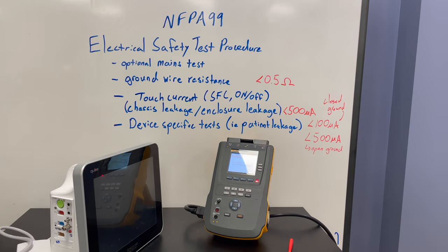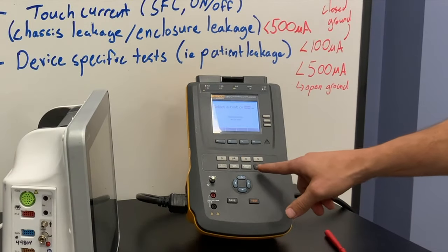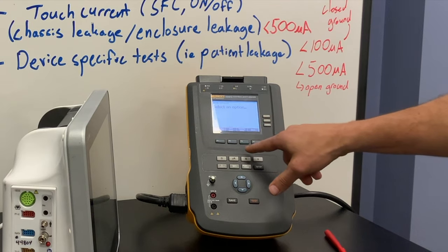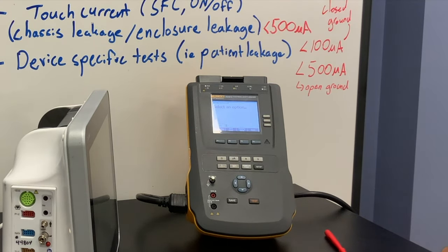You'll notice this unit does not ask for a test standard — it's going to assume the test standard you initially have programmed into the device. But if you do need to change it, you can go to Setup, More, Instrument, and select your standard right there. We're going to leave it on the AAMI ANSI NFPA 99 test standard.